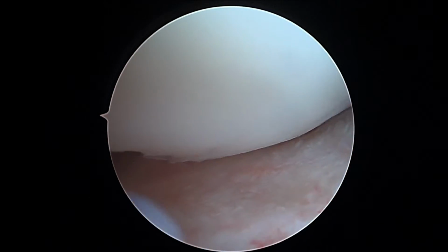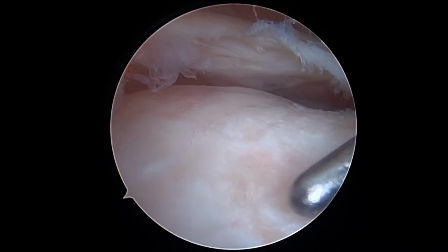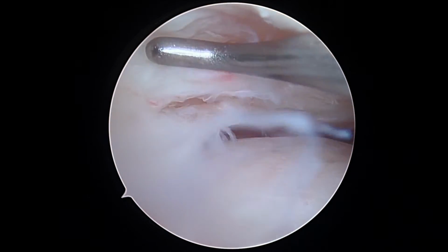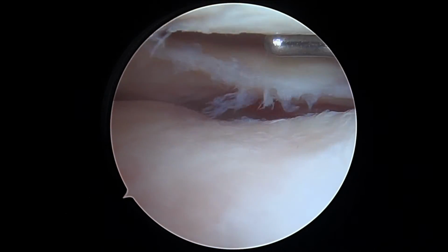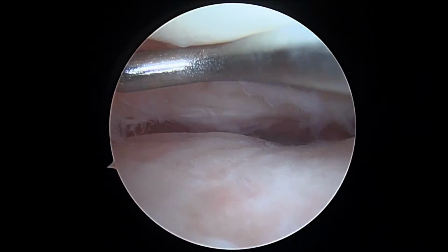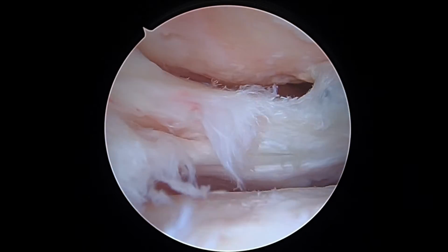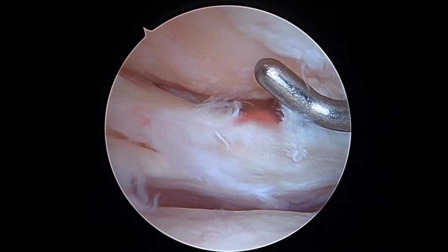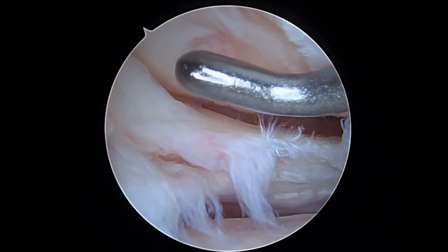And now we're going to start to peek into this lateral compartment where you have a lot of arthritis and this meniscal tear. So we can see the joint surfaces down below. You can see you've lost some cartilage here. You can see this kind of obvious meniscal tear here that we're going to do everything we can to save. You see some wear and tear changes on the femoral condyle with some areas of full thickness cartilage loss. So a lot of arthritis in this compartment. Wish you didn't have all this, but we'll do our best to address it here in just a minute.